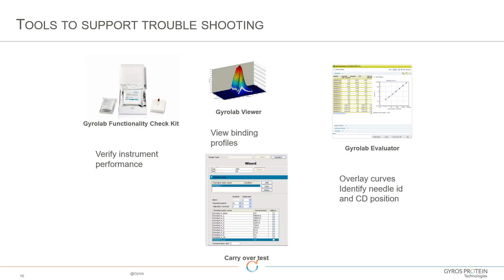To summarize, there are several tools to support troubleshooting: the Gyrolab functionality check kit; the viewer and interpreting viewer profiles, discussed in the previous podcast; the carryover tests we covered today; and within your Evaluator report, you can overlay curves, identify needle IDs, and use that to help troubleshoot various analytical problems you might encounter when running assays.